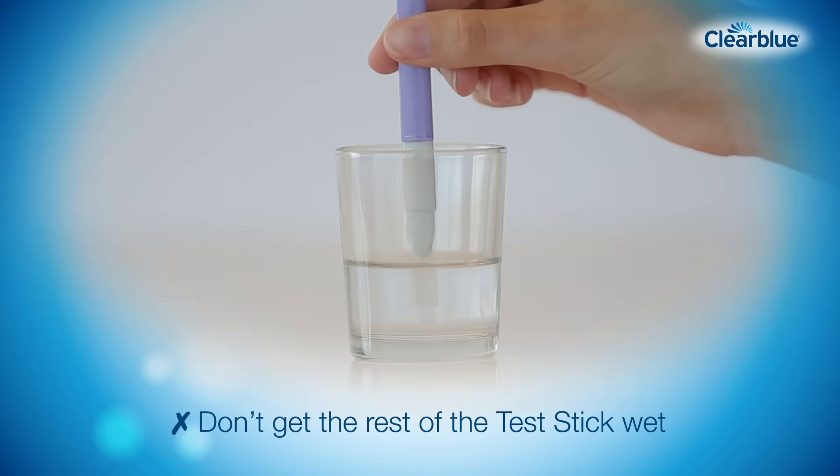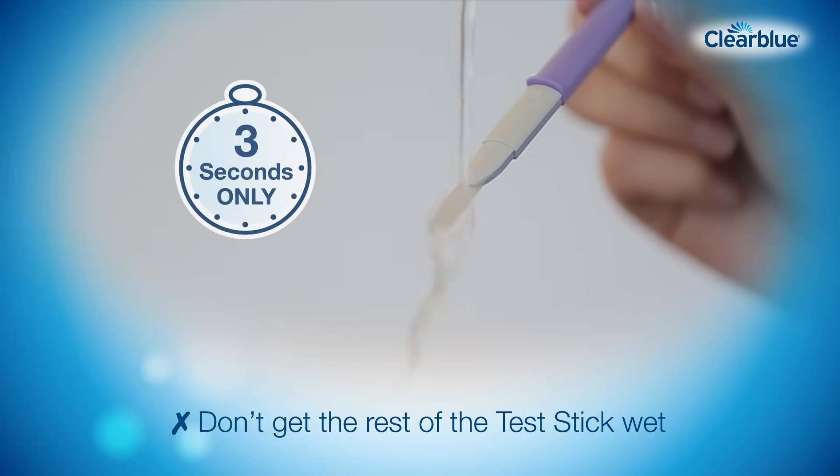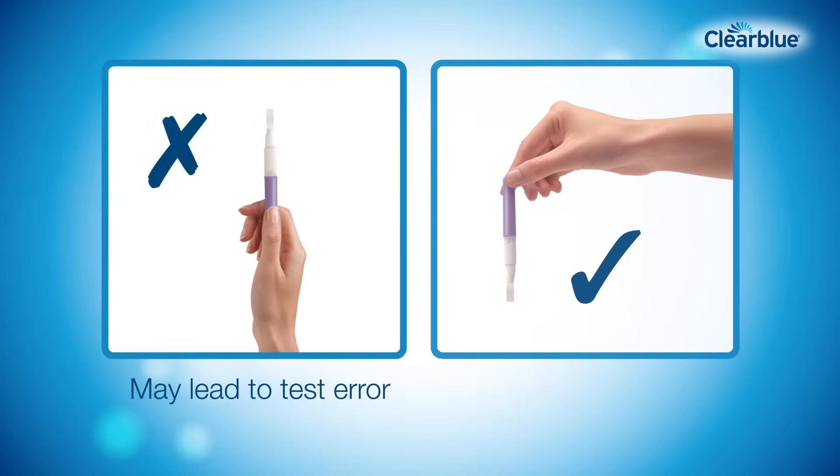Alternatively, you can hold the sampling end directly in your urine stream for three seconds. Throughout testing, never hold the test stick pointing upwards. You should hold it with the sampling end pointing downwards, or lay the test stick flat.